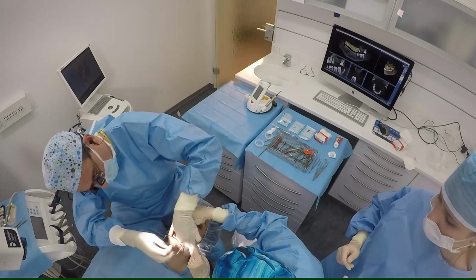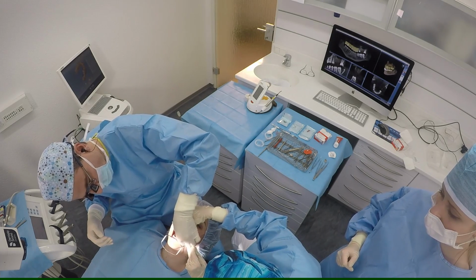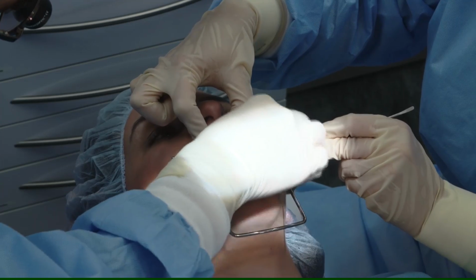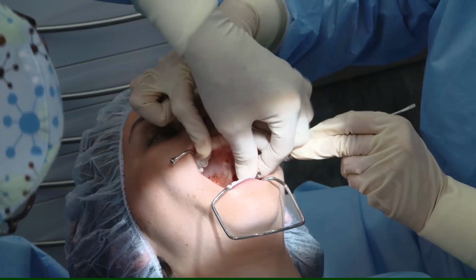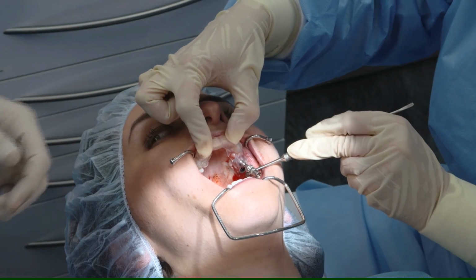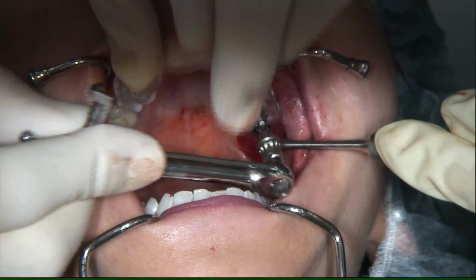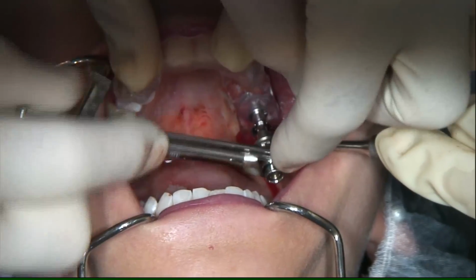And now we are placing the 3.8 millimeter implant into the final position, changing to the ratchet again.